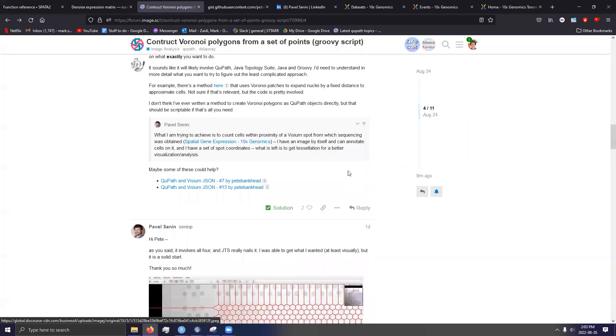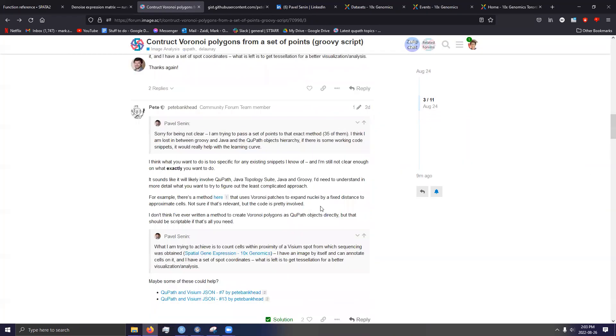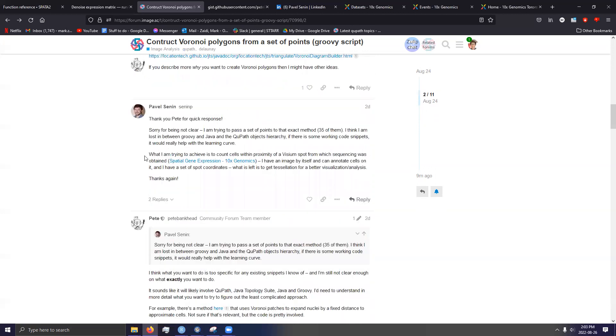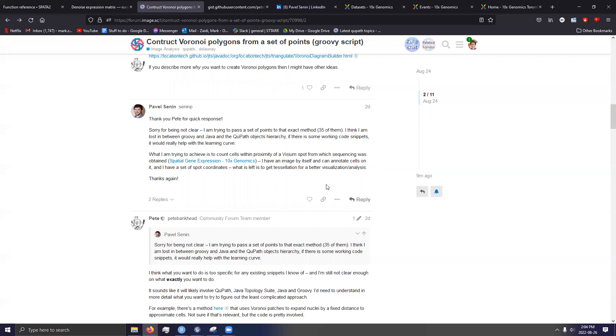And I don't know if it's actually mentioned in this post. Here it is. What I'm trying to do, am I sharing my screen? I hope I am. What I'm trying to do is achieve is to count cells within proximity of a Visium spot from which sequencing was obtained. I have an image by itself and can annotate cells on it and have a set of spot coordinates. What is left is to get a tessellation for better visualization or analysis.